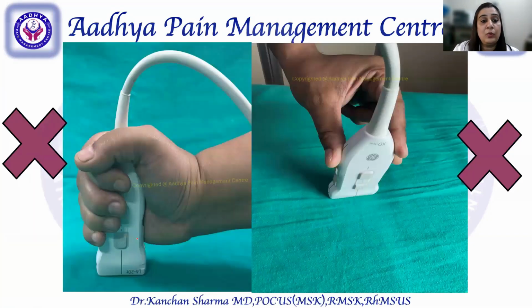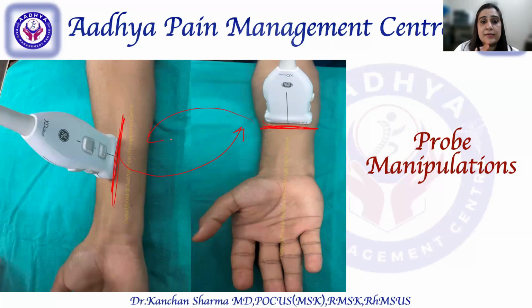I have seen people holding it like this as if they are going to stab the individual, or it is such a delicate thing that they'll be holding it from here. So this is absolutely wrong. Please do not do it. One axis is not at all convincing to just say that this structure is pathological. It has to be two axes, okay?